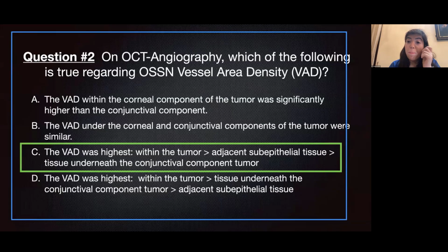However, the patients have to be very still, whereas with anterior segment OCT, we really have a lot more freedom and flexibility. But here, patients have to be very, very still. And it's very much technically dependent, technician dependent, user dependent as compared to anterior segment OCT.